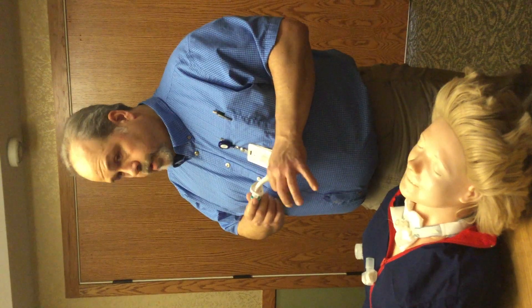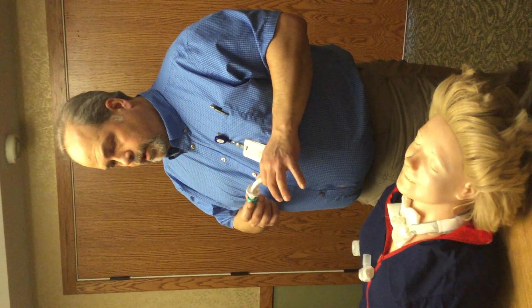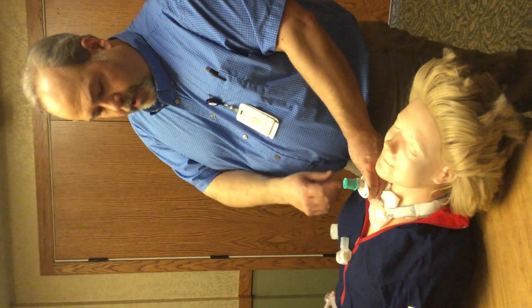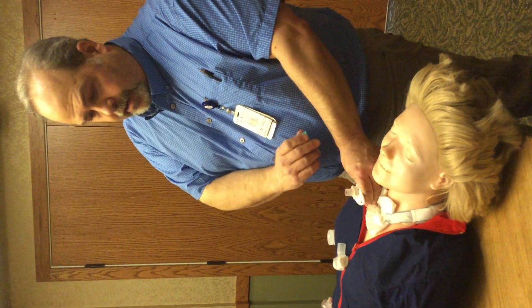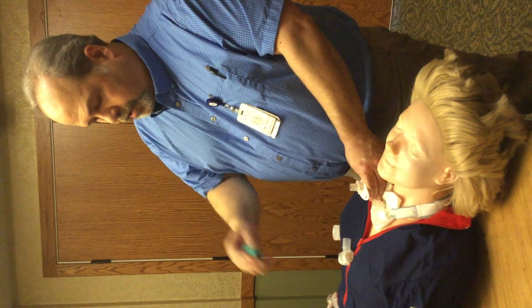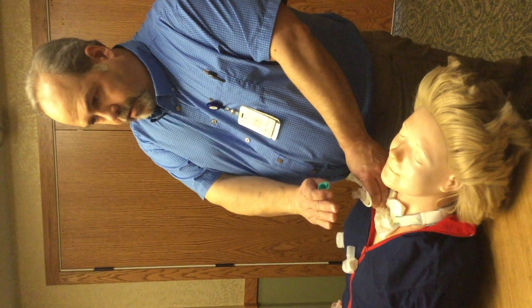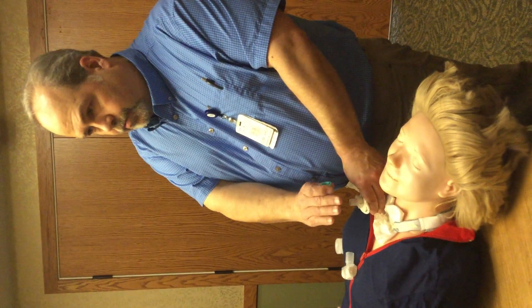This gets you close to your normal airway — you can cough and clear some. Beware: you never want to stand in front of the tube when you take the speaking valve off, because when they cough, a lot of times it will come out. Sometimes I'll put a towel on the chest. If I have gloves on, I'll let them cough when I pop it off.